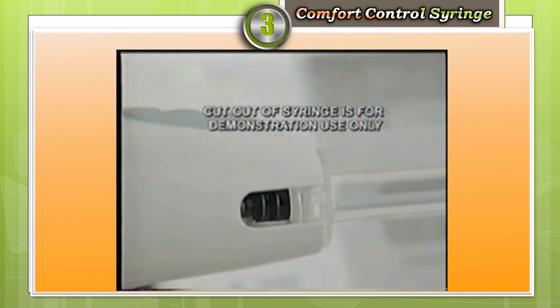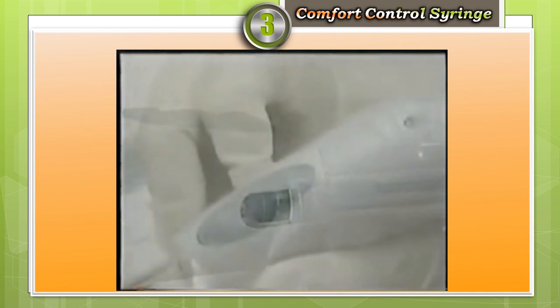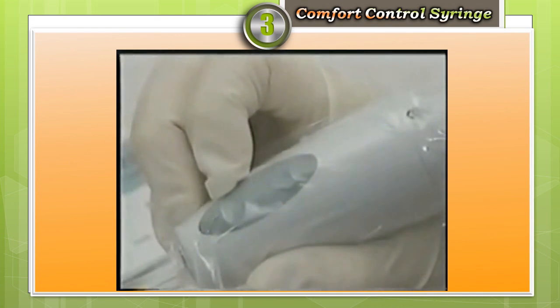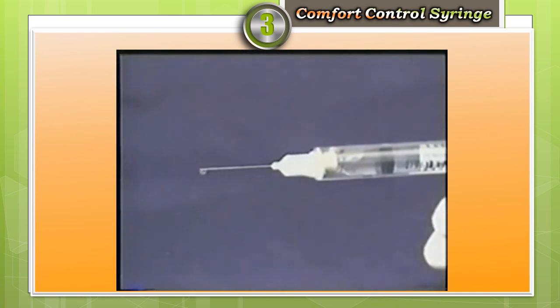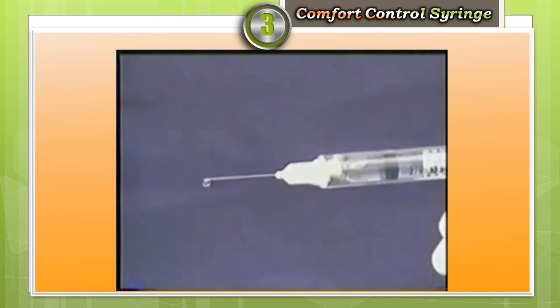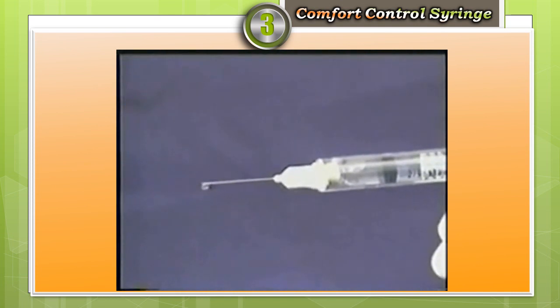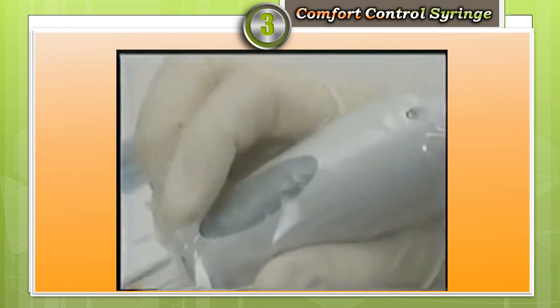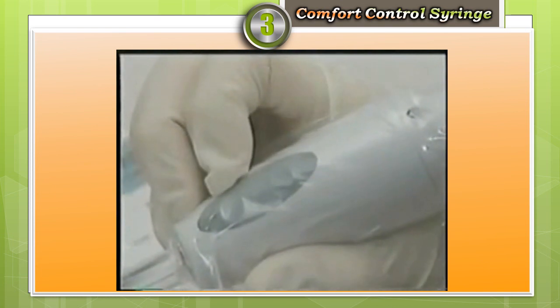Again, the CCS's clear plastic holder gives you full visibility of the cartridge. After negative aspiration is achieved, press start to initiate the injection. You can see the slow rate at which the anesthetic is delivered. This rate lasts 10 seconds for patient comfort. Then the injection rate automatically increases to the pre-programmed or regular phase for the injection type selected. You may stop the injection at any time by simply pressing stop.